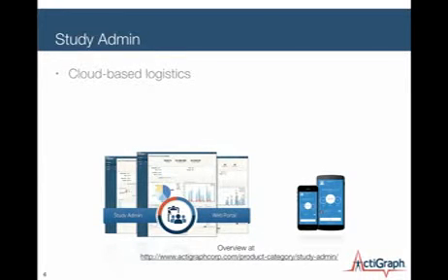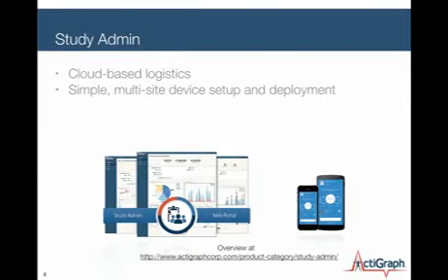So our study admin system is a cloud-based logistics platform. You access the system itself through a web portal. Many of you have used some web-based email like Yahoo or Gmail. You go to a website and you're prompted with a username and password, and that's the way our system works. You, as the study coordinator, have access to that system using a username and password. It's focused on simplifying your device deployments.